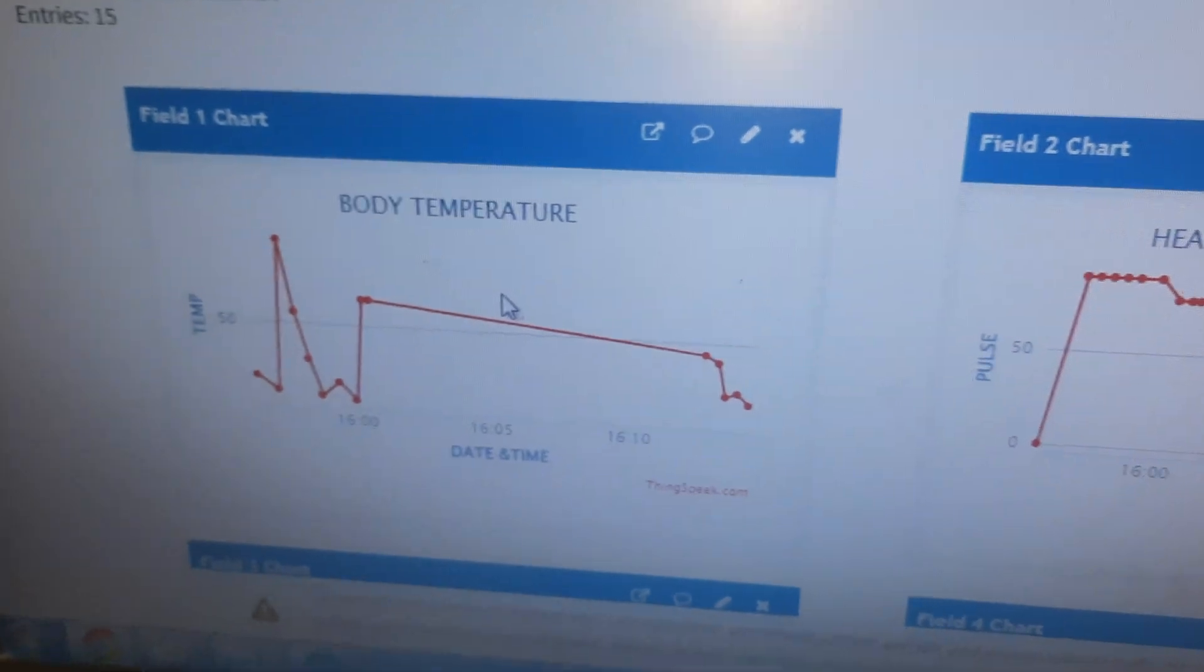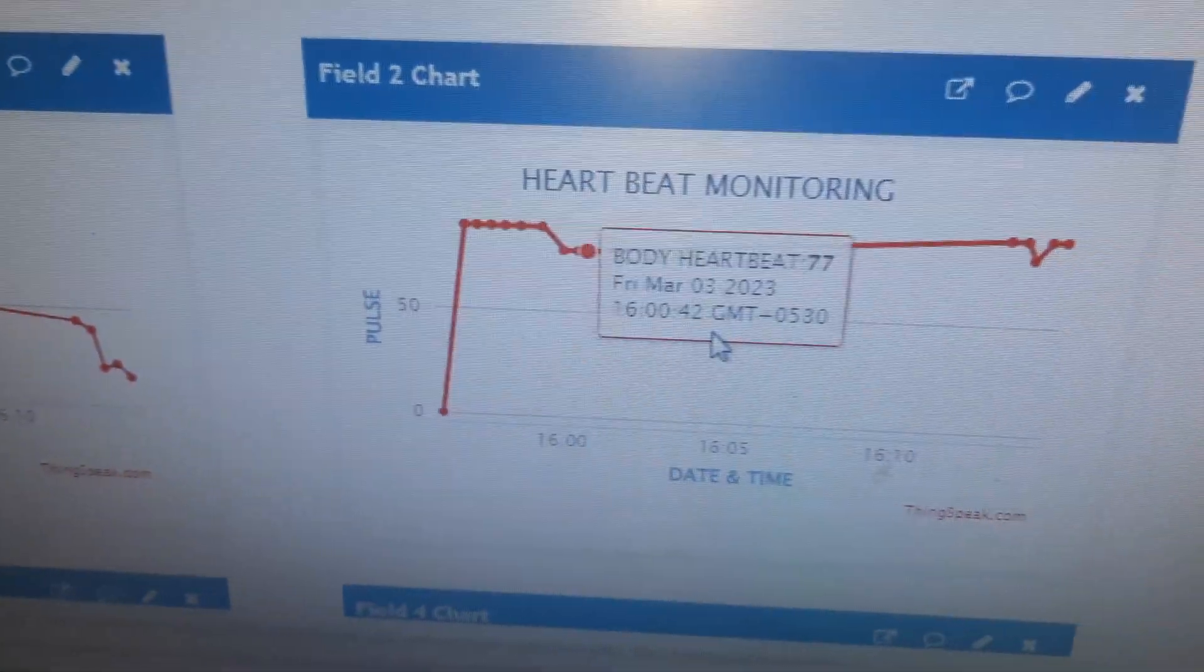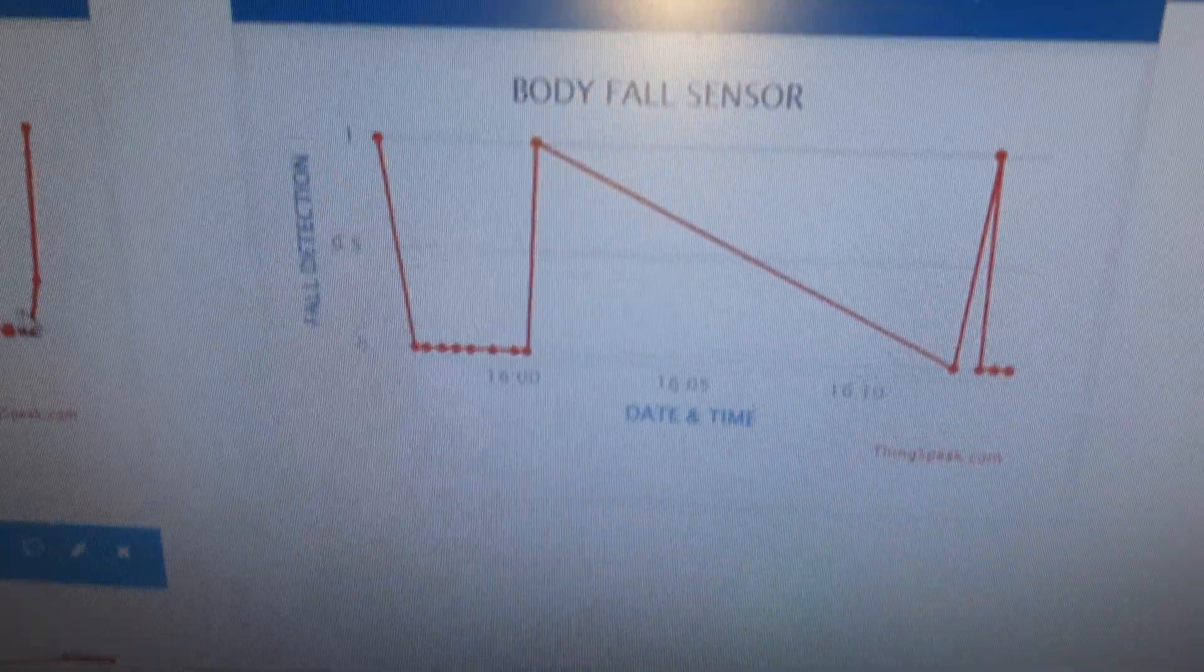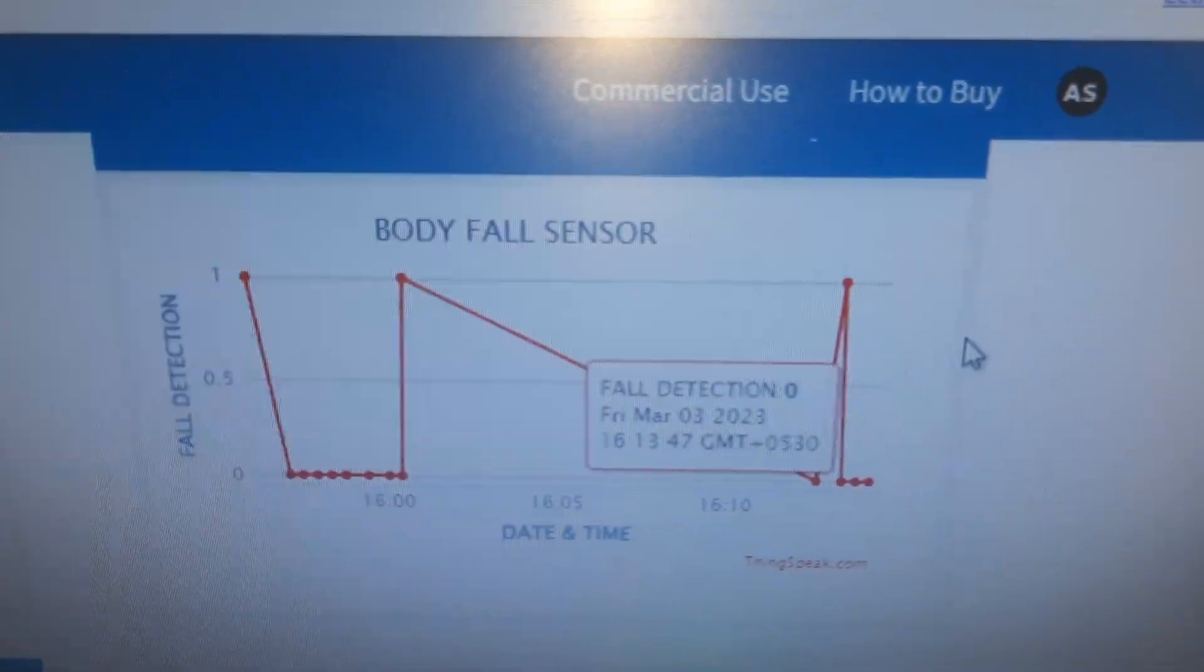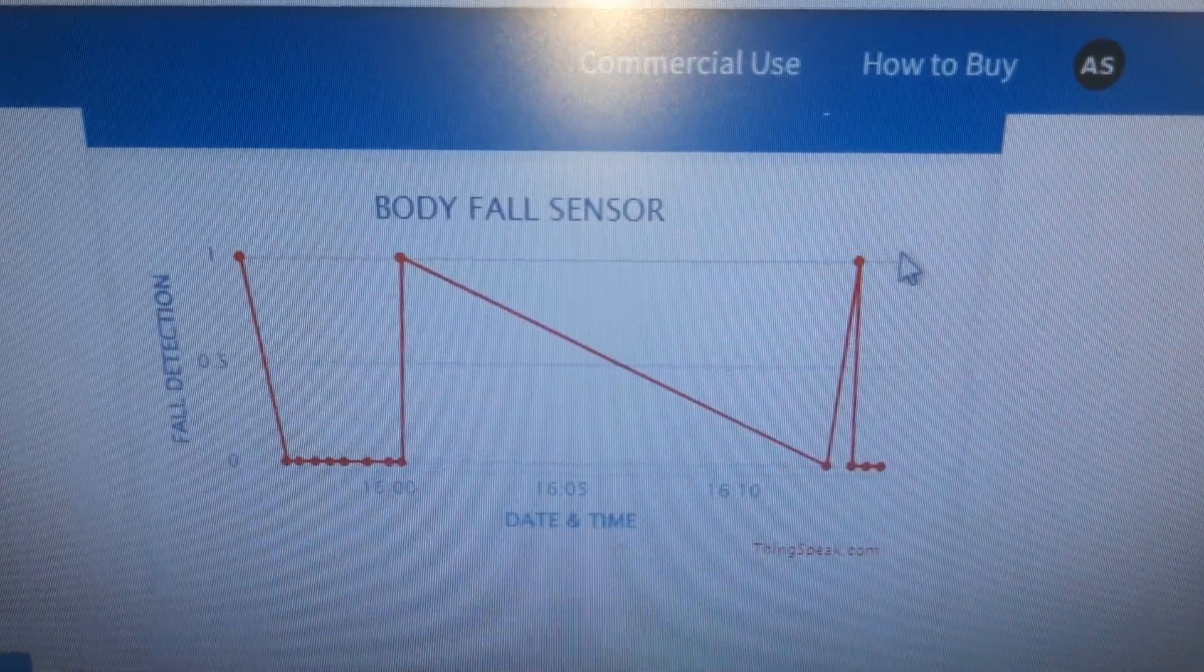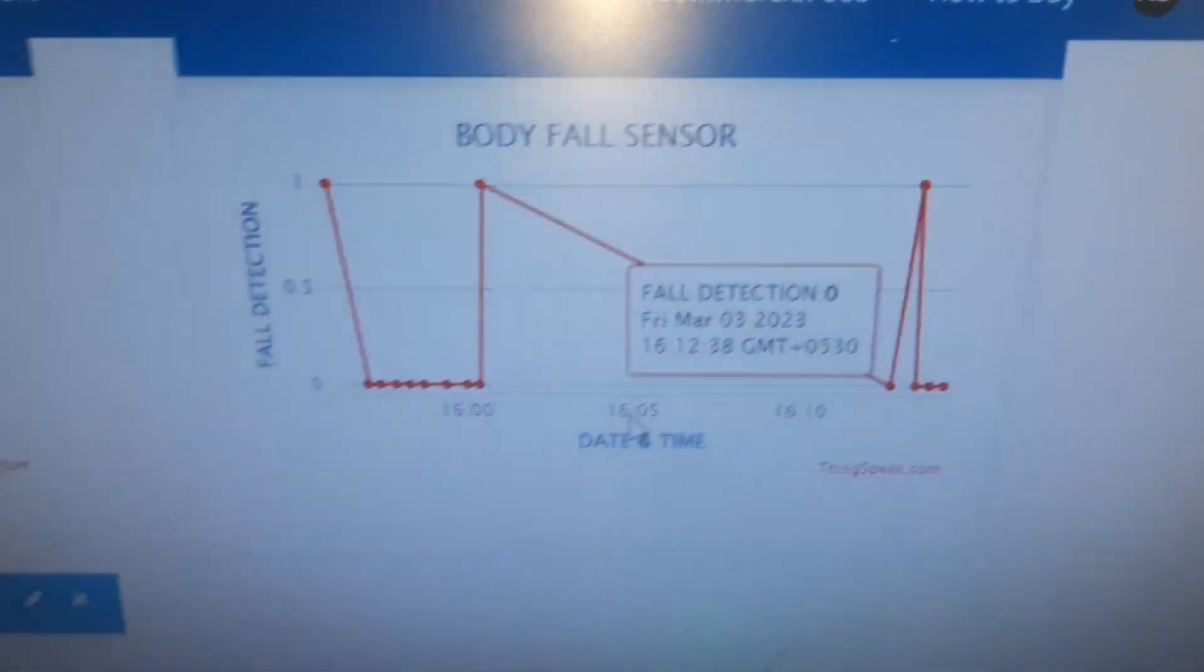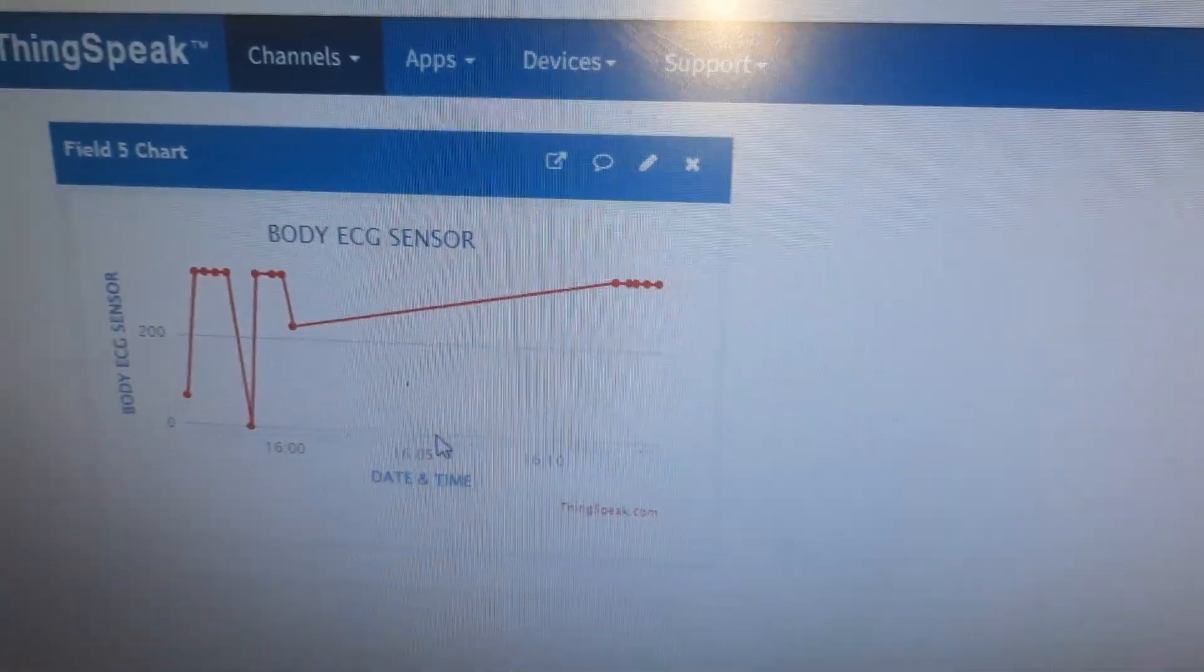We have body temperature, heartbeat values, humidity values, and body fall detection. It goes high when fall is detected, goes to 0 when there is no fall, and we have ECG value.